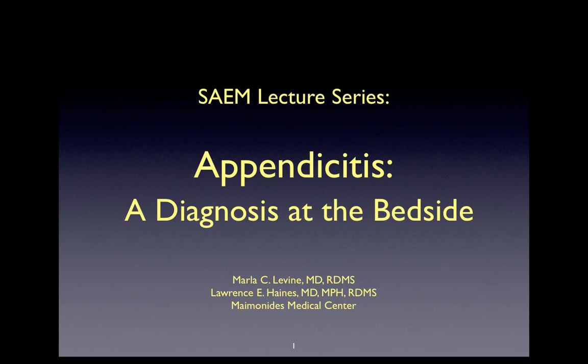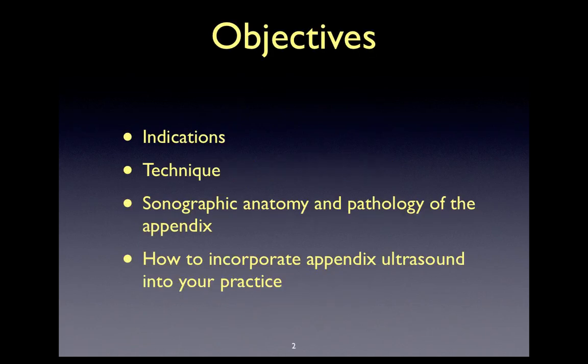This is Marla Levine, and today we will be discussing bedside ultrasound as an imaging modality for the diagnosis of appendicitis. The objectives of this talk are to describe the indications and technique for performing the appendix ultrasound. This will be followed by a review of the sonographic anatomy and pathology of the appendix, and then we'll discuss how to incorporate the appendix ultrasound into your practice.